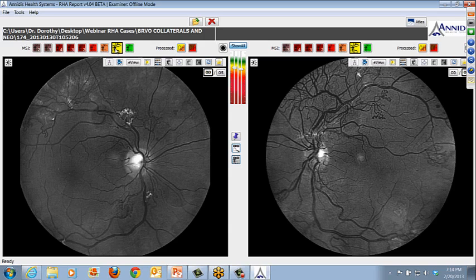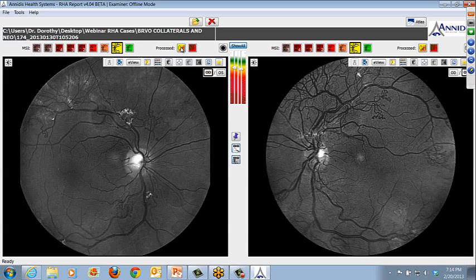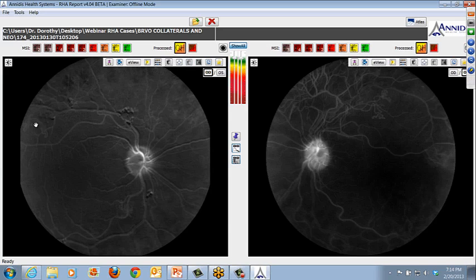a combination of the yellow and the amber, and the technician should have retaken the image here in the amber. This should have been clearer, and if they did that, then your oxy map would be reliable here. It is not reliable in this format. You can see the difference between those two image sets here, okay?